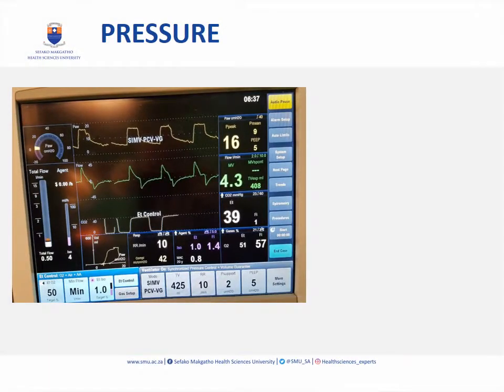That we said we were going to set is the pressure. All right. Now regarding airway pressures, there are 2 things that we need to set. The peak inspiratory pressure, or the PIP, and the positive end expiratory pressure, or the PEEP. Good. Now the peak inspiratory pressure is the highest pressure that will occur in the patient's airways when you are giving a breath with a ventilator.